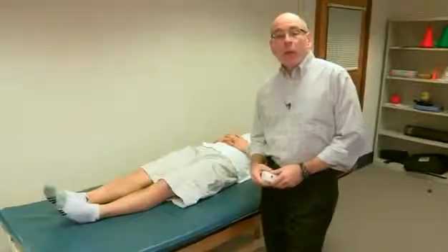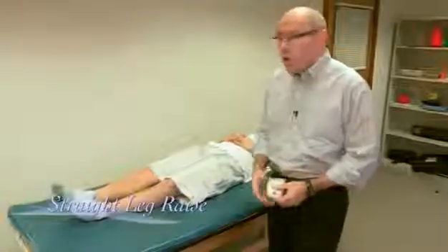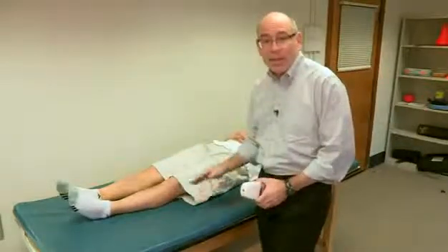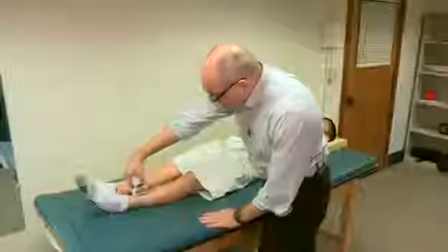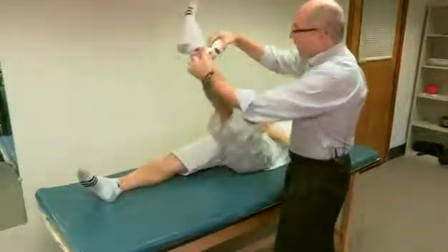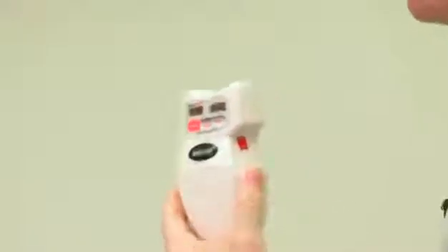Now we're going to measure a couple of lower extremity ranges, starting with the straight leg raise. Our assumption here is that the subject is horizontal and that his leg segment is basically horizontal as well. I place the inclinometer on his leg and set it. Keeping your knee straight, raise this left lower limb as high as you can. I click it again. We ended up with 61 degrees of active straight leg raising on the left side.